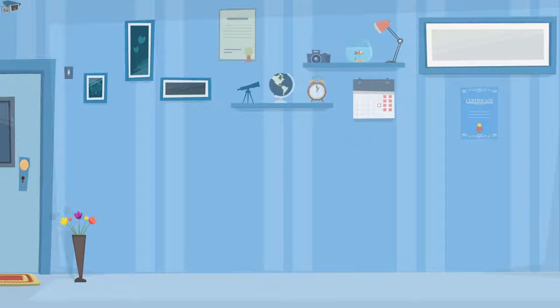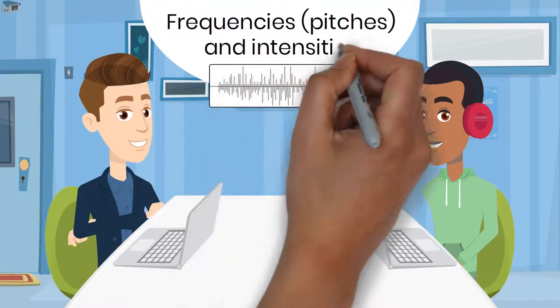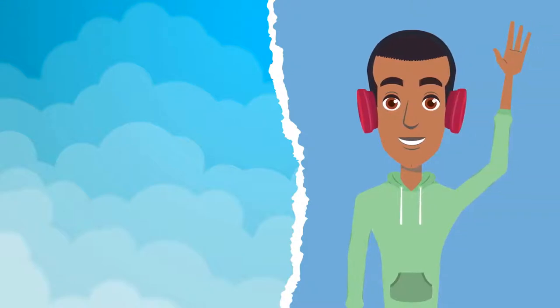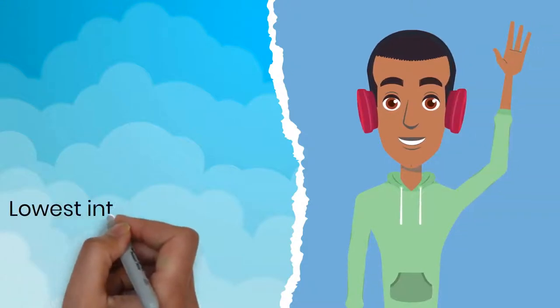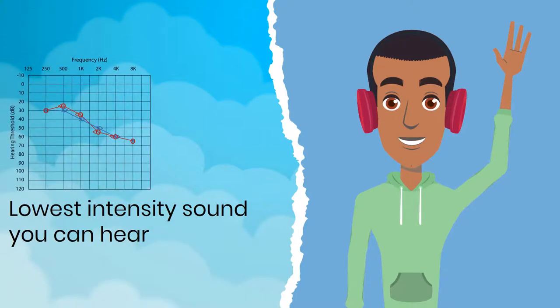During your hearing evaluation, a hearing professional will present tones at specific frequencies, pitches, and intensities. When you hear the sound, you will respond by raising a hand or pressing a button. The hearing professional then records the lowest intensity sound you can hear, which is plotted on the graph.